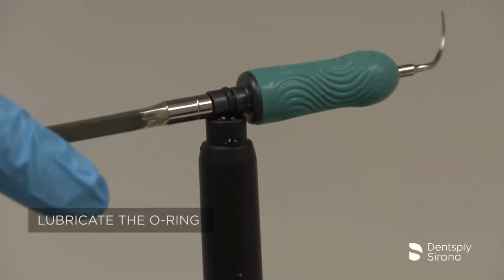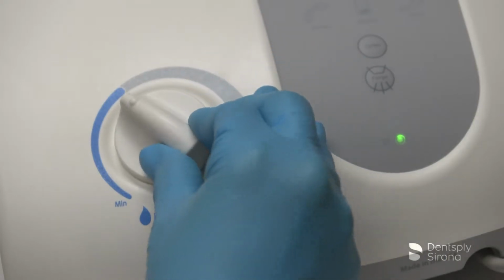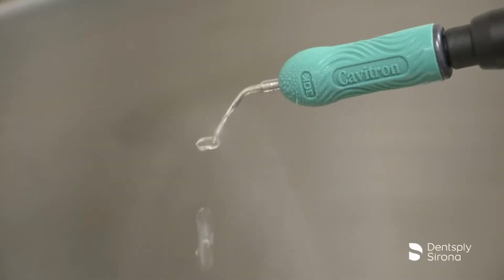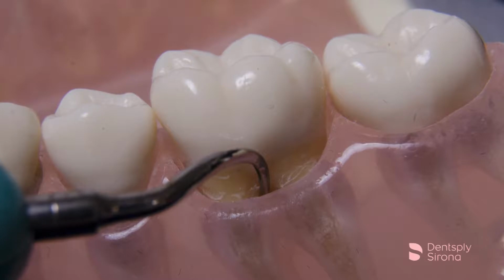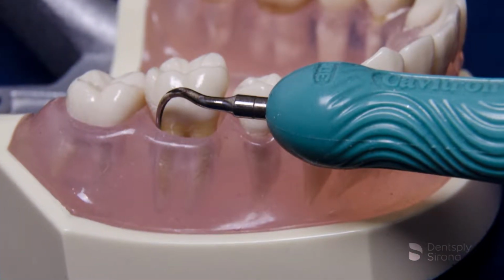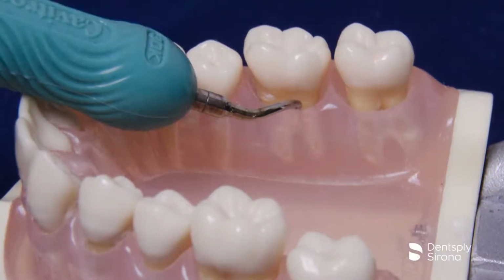After the clinician has filled the handpiece with water, seated the insert, selected the power, and adjusted the spray properly, instrumentation begins according to the treatment plan prescribed for the patient. When access is indicated in deeper pockets, in particular the posterior teeth, a curved insert is often necessary to maintain true adaptation of the terminal 2 to 3 millimeters at all times.